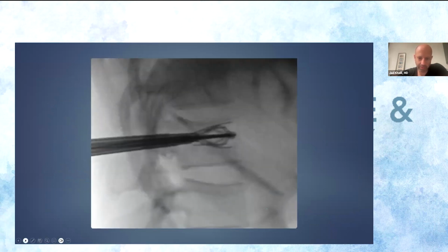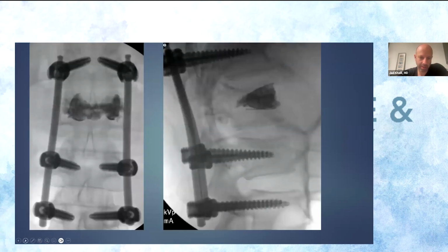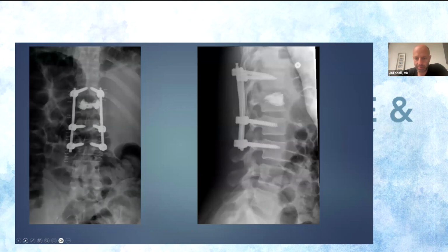We have, I think, multiple shots here just showing that expansion of the superior end plate. Then we put the cement, take an AP, and then I go ahead and put in my percutaneous screw fixation. These are not open fusions. These are perc screws. They go pretty quickly. Somebody asked me one time why I didn't put any cement in that L2, and I honestly don't recall, but I didn't feel like I had to.